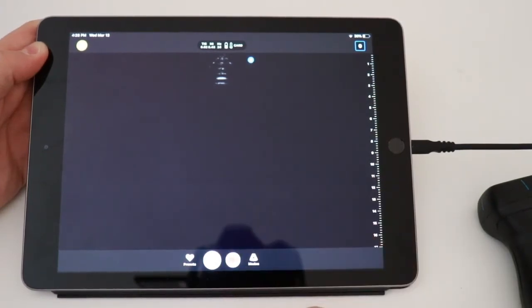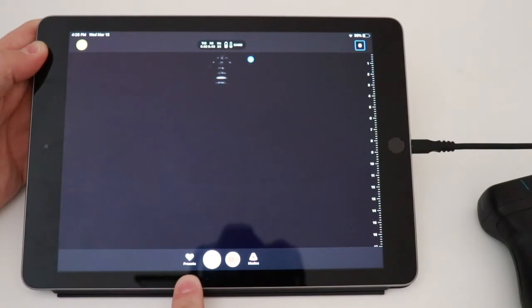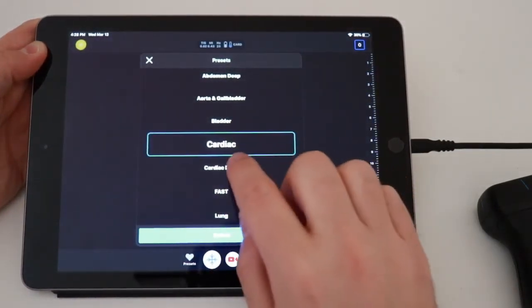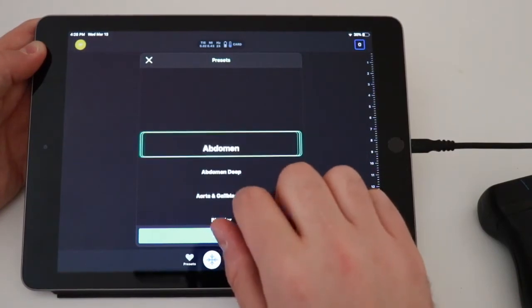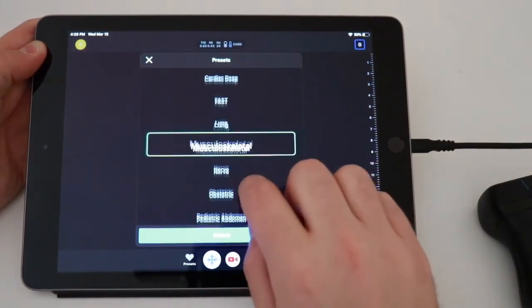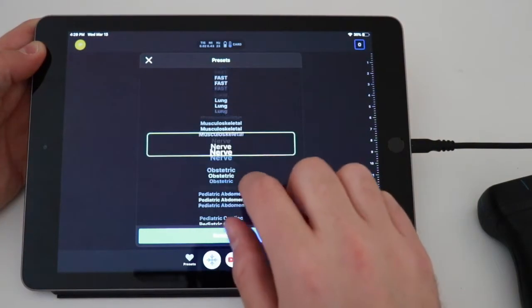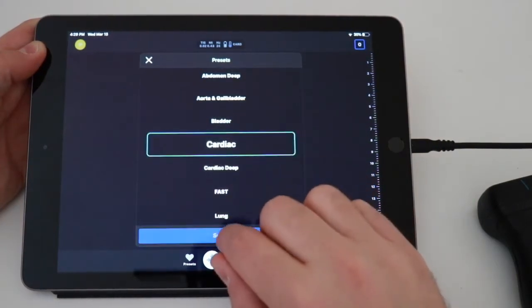Again, if you want to change an exam, you go to this heart down here. These are your presets. And you'll see a number of different exams here. We're on cardiac right here. We can change to abdomen. We can change to musculoskeletal. We can change to soft tissue, etc. Let's go to cardiac real quick.